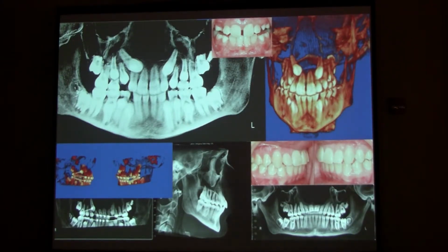Here's another case, by contrast, that's equally complicated, that was intercepted early, but maybe even too late. You can see canines lurking dangerously close to the central incisors. But they're caught. 9 millimeters of crowding, no space, could have been intercepted way earlier. But even at that late stage, we can successfully bring it in and imperceptibly land it into position on either side if it's managed correctly.